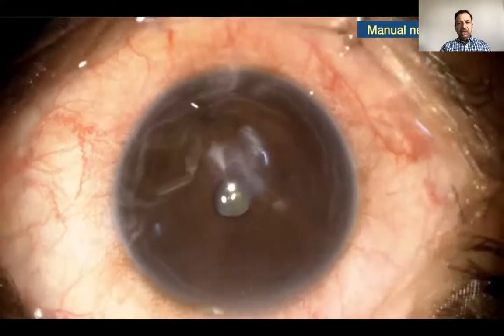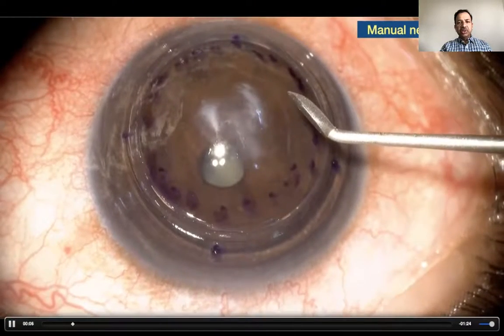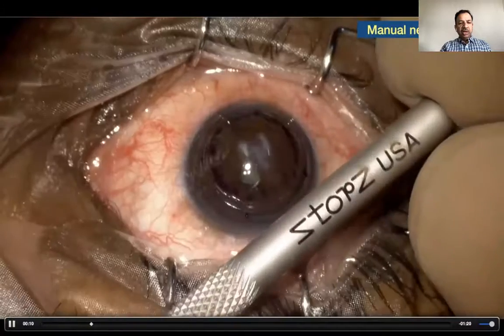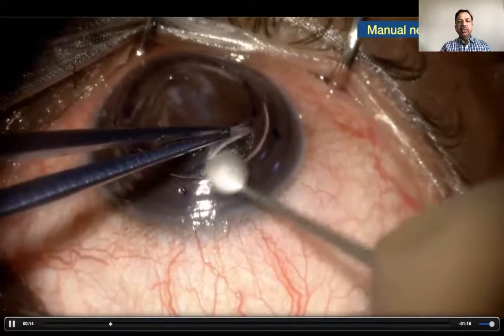A similar technique is used when you are dealing with advanced keratoconus or scars involving the Descemet's membrane, where you do not want to use any form of air injection. So this is a stromal dissector that I designed.